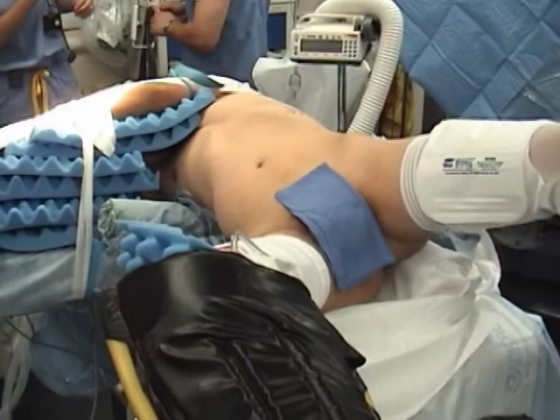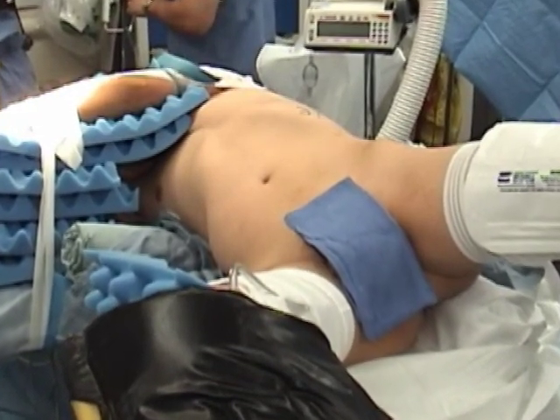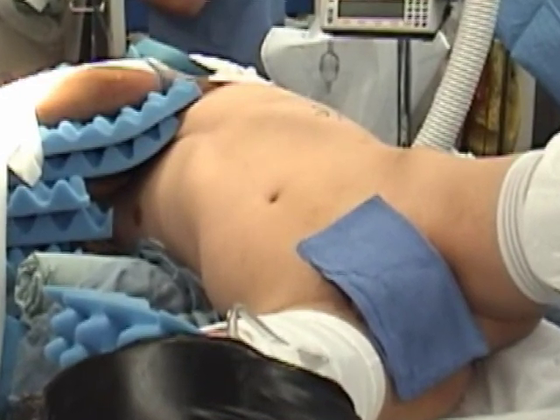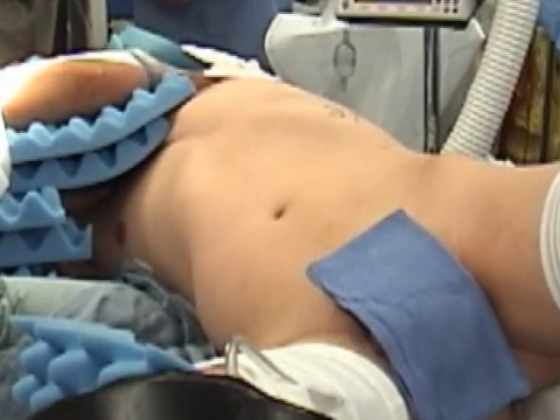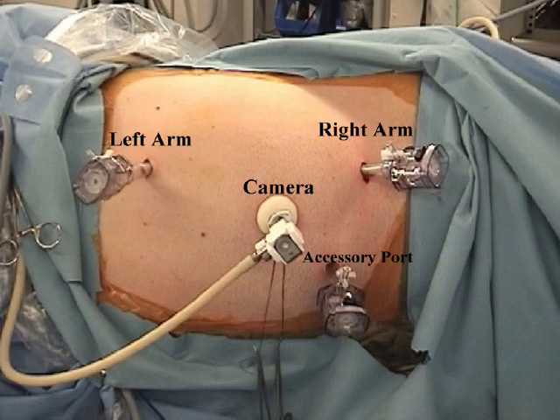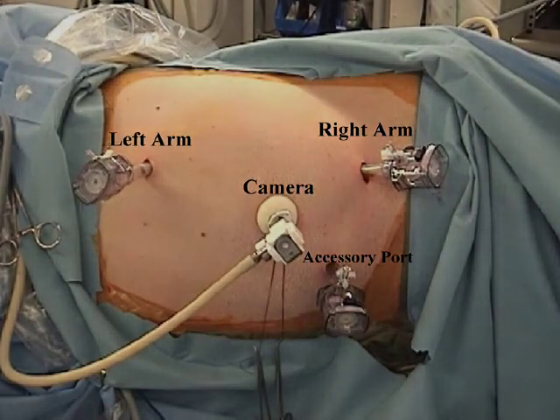The patient was positioned in the semi-lateral position with both legs out in stirrups. This allowed access to the genitalia as well as the ability to place a cystoscope and/or a ureteroscope up the left ureter during the operation if necessary. Trocar placement is identical to that used for robotic pyeloplasty: camera at the umbilicus, robotic arms along the midclavicular line, and an accessory port in the contralateral lower quadrant.